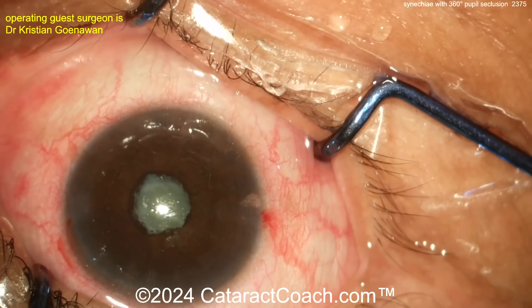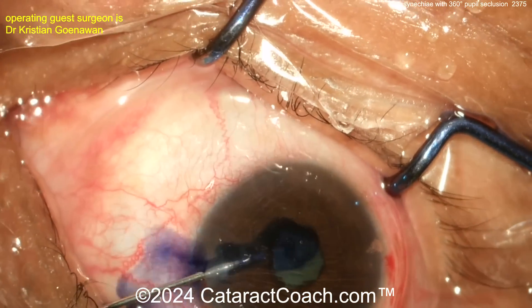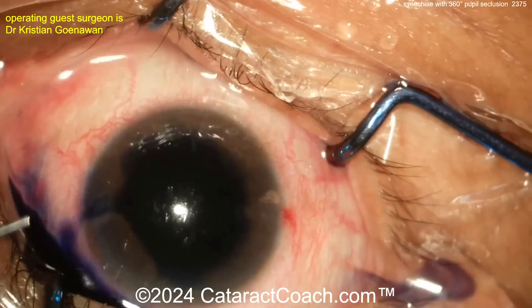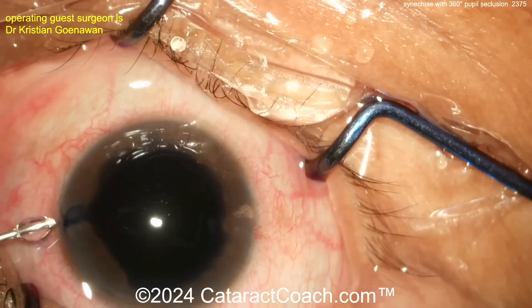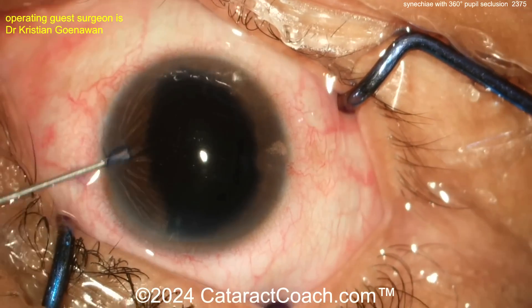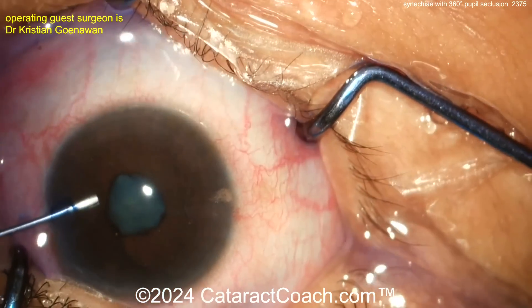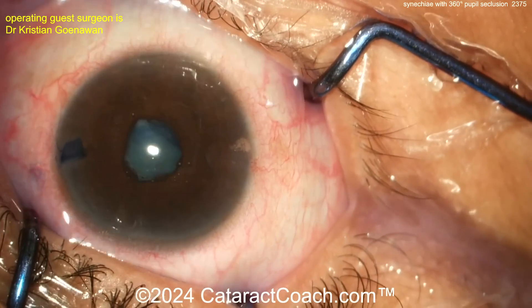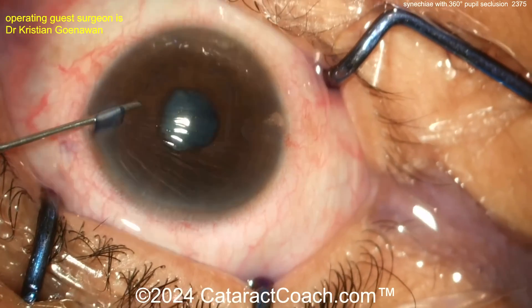Using the viscoelastic cannula to inflate the anterior chamber and begin separating the synechiae. When applying trypan blue dye, be cautious — you need to get the dye under the iris as well, because you want to stain not just the central two or three millimeters of the capsule but all of it. Sometimes put an extra drop or two underneath the iris in various quadrants to get a full stain.